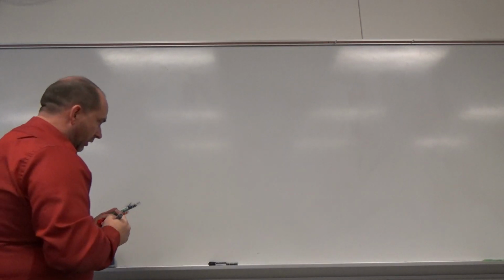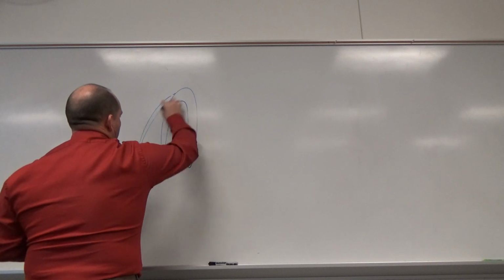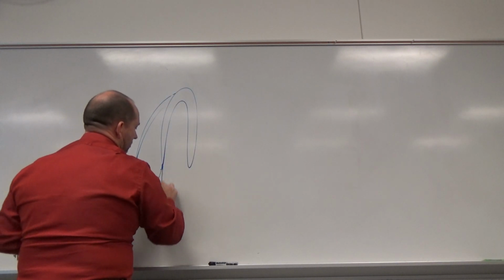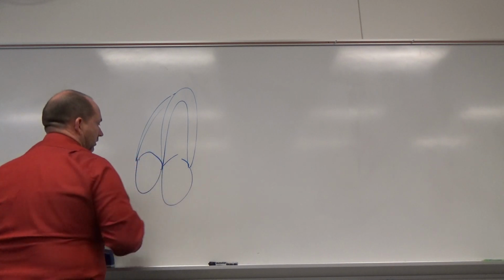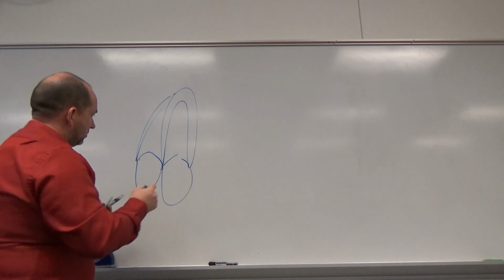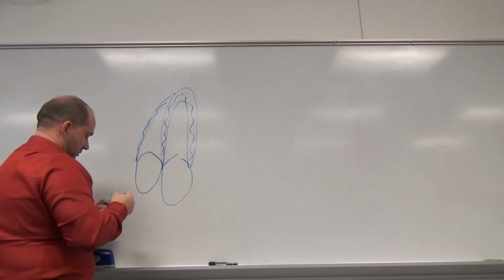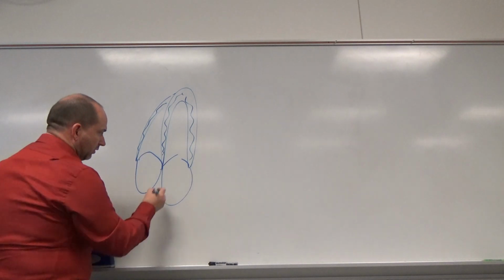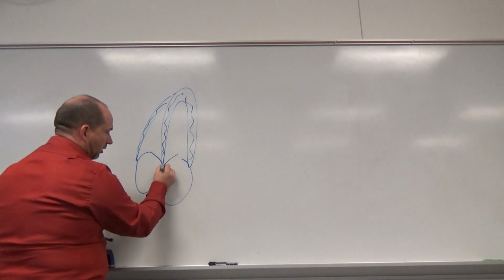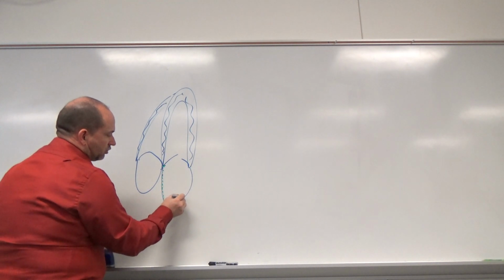All right, just because I'm going off the top of my head here as I go through this, I forgot that we need to also measure the atria and compare the left and the right atria from the apical 4-chamber perspective. A lot of times we're going to do a volume measurement for this, like a Simpson's. So we're going to start at the annulus, and we're going to trace around the inside of the chamber.